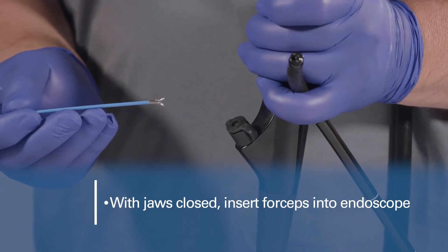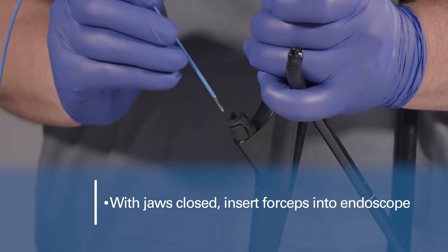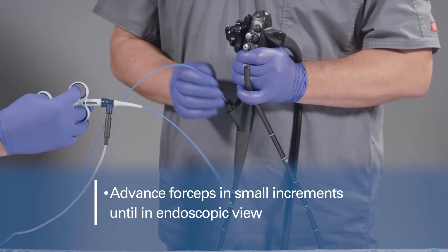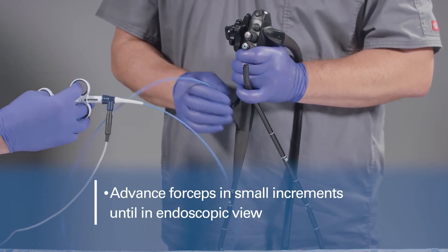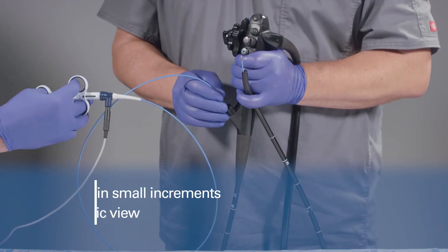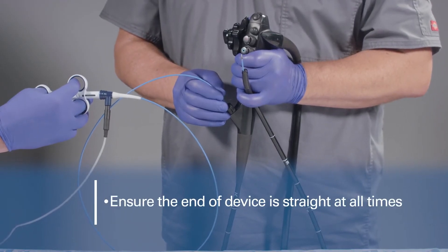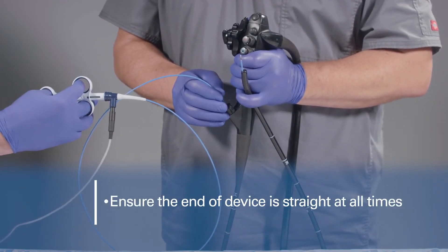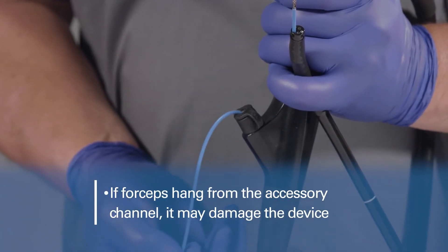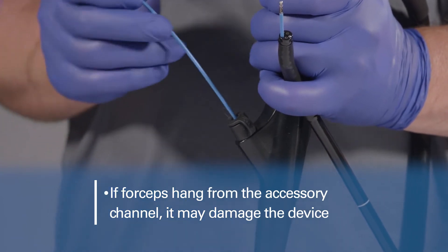With the jaws closed, insert the forceps into the accessory channel of the endoscope. Advance the forceps in small increments until it is in endoscopic view. Ensure that the end of the device that extends from the accessory channel is straight at all times. If the forceps hang from the accessory channel, it may cause damage to the device.